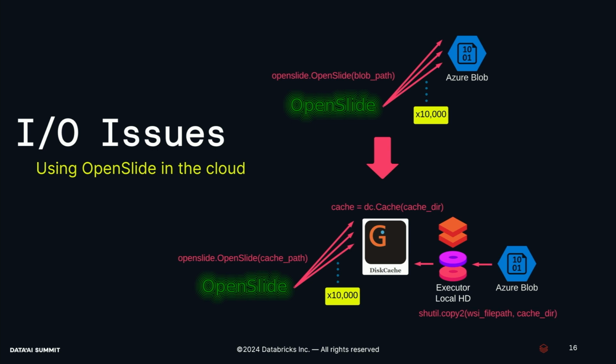The thing that happens if you're using OpenSlide is kind of weird. It's operating in this pyramidal TIFF sort of format, and it wants to know where all the things are that it needs to open. So it doesn't actually pass data, but it opens up a ton of objects, let's say 10,000. On a local hard drive this doesn't cause a problem, but those concurrent opens really, really clog up blob storage. So it's very difficult to actually use OpenSlide here, and you get terrible performance.